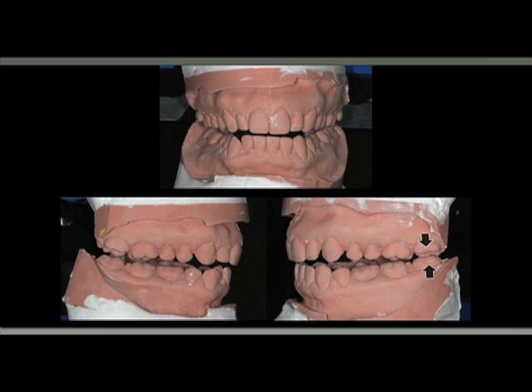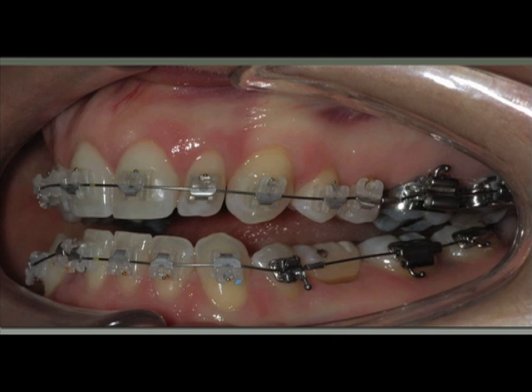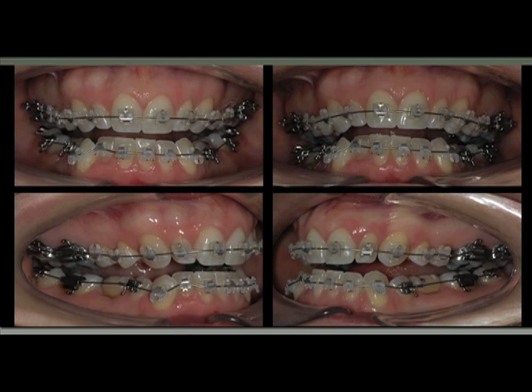As you all know, 1 millimeter of difference of the vertical in the back means sometimes 2 or 3 millimeters in the front. And I will show you just how I corrected this case by leveling and aligning and providing the right amount of torque on the molars. So here's the case, the day I placed the braces, bands on the second molars. You can see this zoom of the photograph, where I like to highlight the contact of the second molar, the upper with the lower.